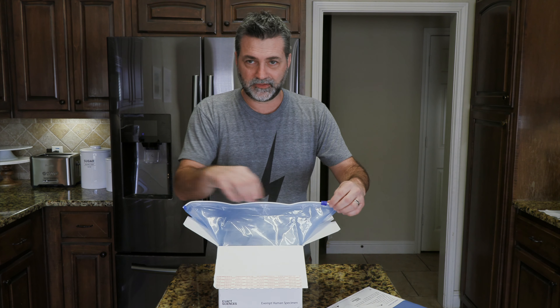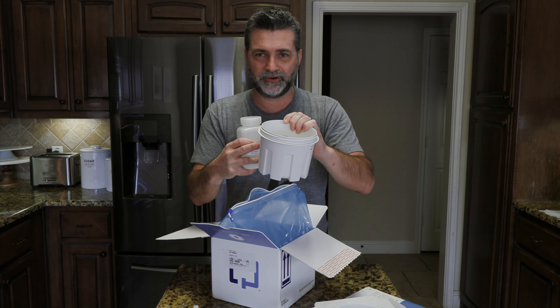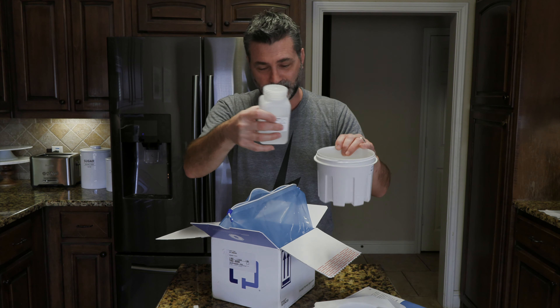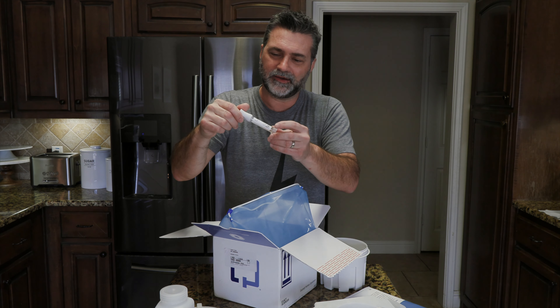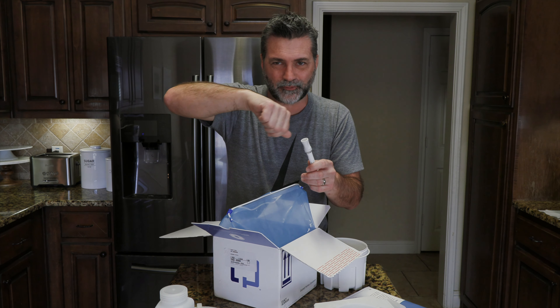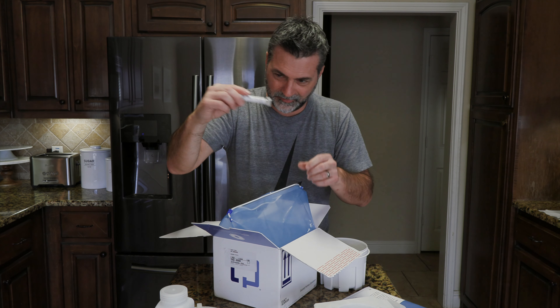There's also this liquid. After you do your business in this — and when you do your business, you don't want to have any urine or toilet paper in here — you need to do what you need to do, then close it up and pour this in there. But before you do that, there is this little brush — it almost looks like an eyelash — and you're supposed to take this and sort of scrape some. Then you put it down in here and close it back up.